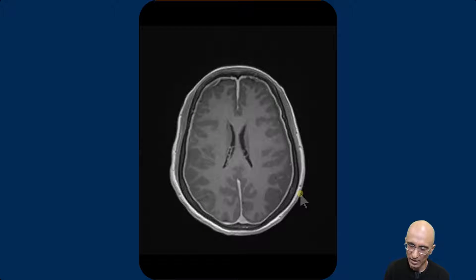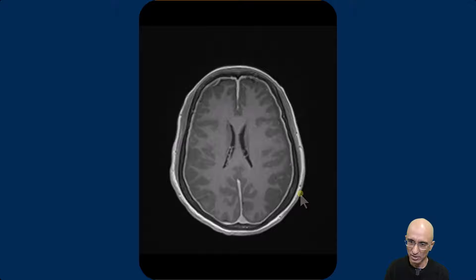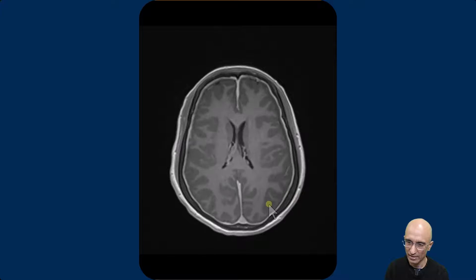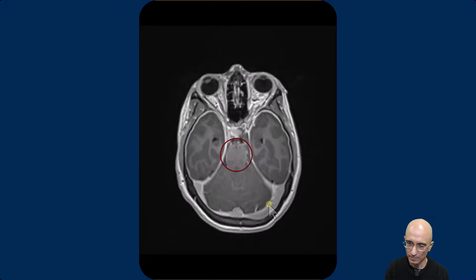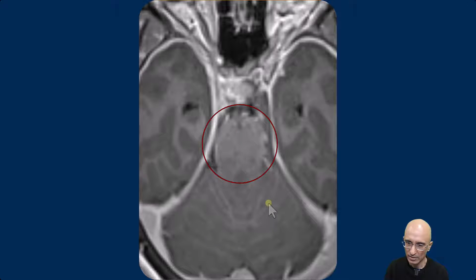The patient subsequently underwent MRI brain examination. On the MRI brain examination, you can clearly see thickening of the dura with enhancement. And as I scroll down further, if you look at the interpeduncular region of the midbrain, there is marked narrowing of the interpeduncular angle.